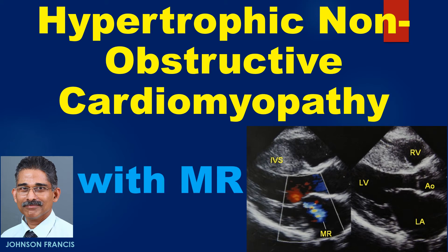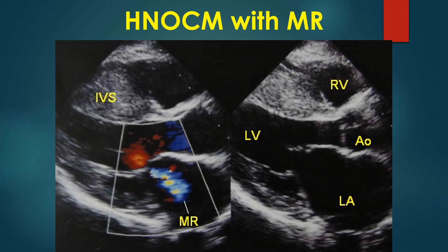Color Doppler echocardiogram from the parasternal long axis view in hypertrophic non-obstructive cardiomyopathy shows a grossly thickened interventricular septum. The posterior wall of the left ventricle does not show much hypertrophy. This type of hypertrophy is called asymmetric septal hypertrophy and is characteristic of hypertrophic cardiomyopathy.